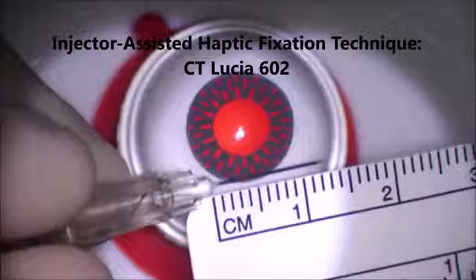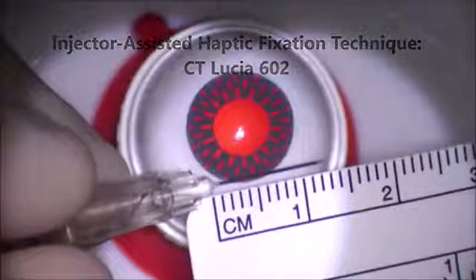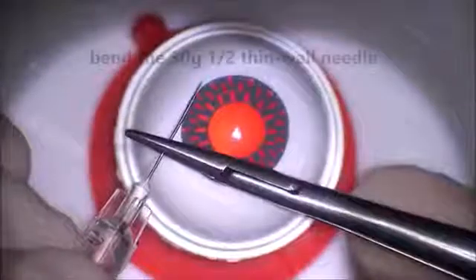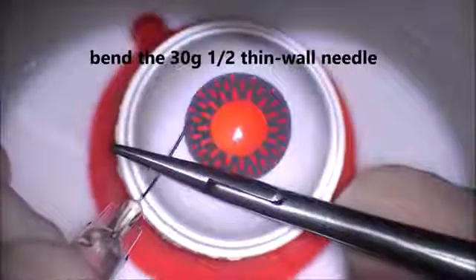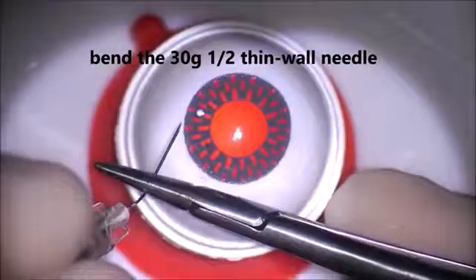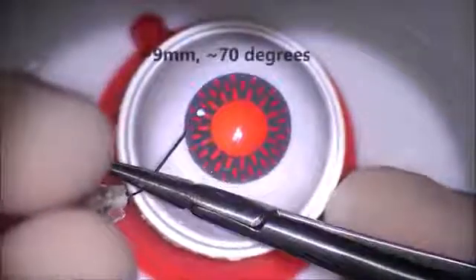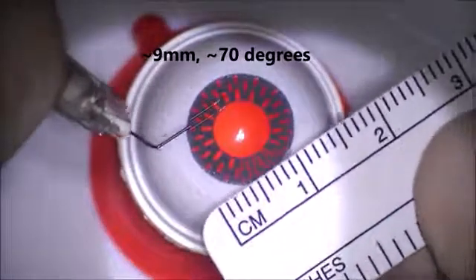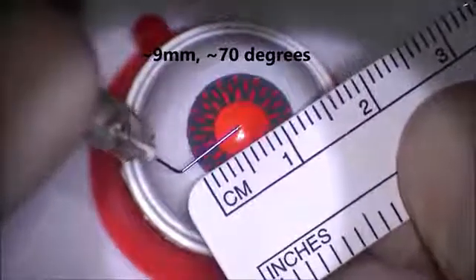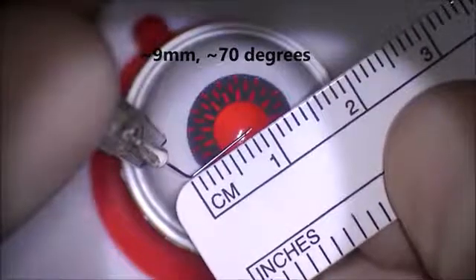This is a 30 gauge thin-walled needle, which is essential for this technique. I'm going to bend the 30 gauge half inch thin-walled needle about 70 degrees, and it's going to be nine millimeters in length from the tip. I'm using a needle driver to do this. The bevel is going to face the approach of the haptic — this is very important.